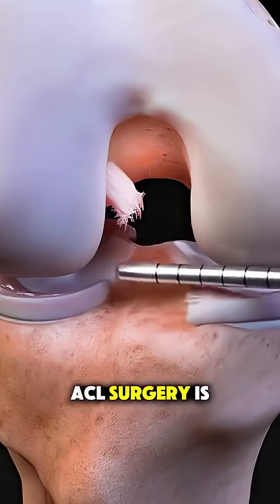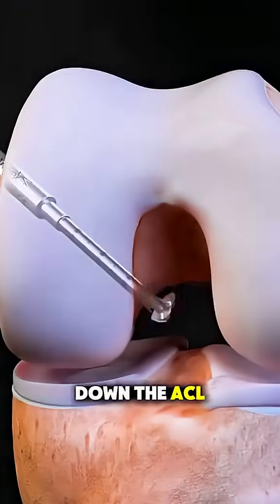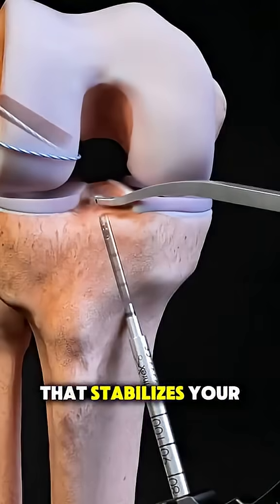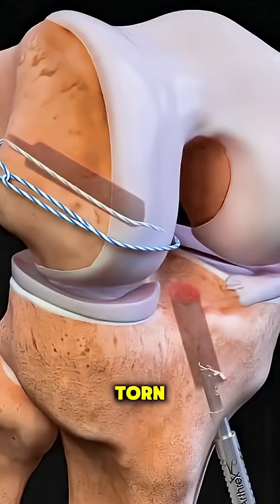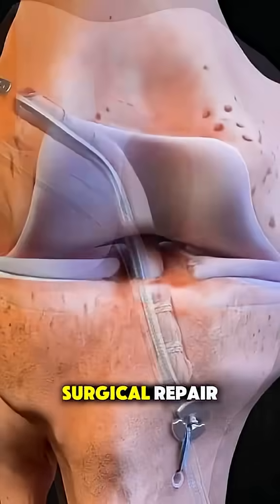Ever wonder how ACL surgery is performed? Let's break it down. The ACL is one of the main ligaments that stabilizes your knee, and when it's torn — usually from sports or sudden twisting movements — it often needs surgical repair.